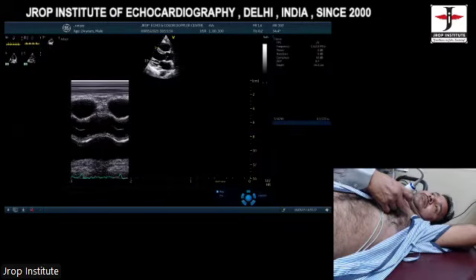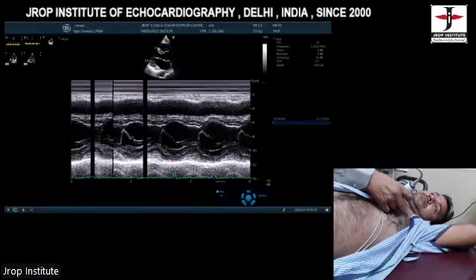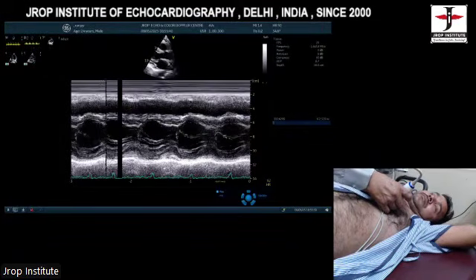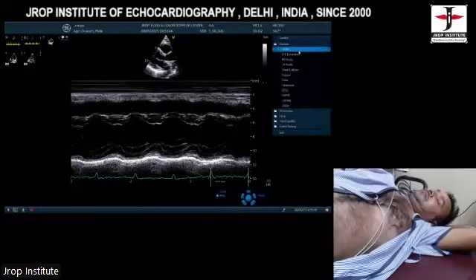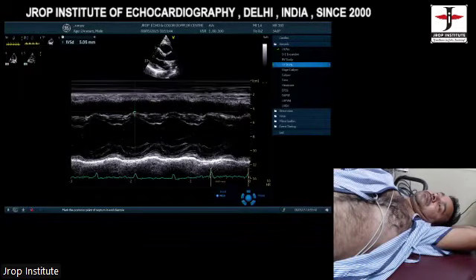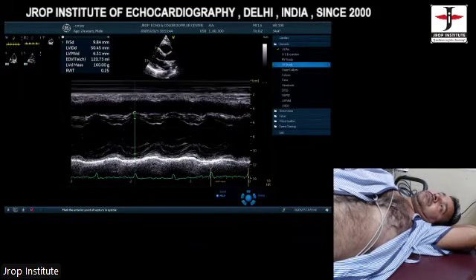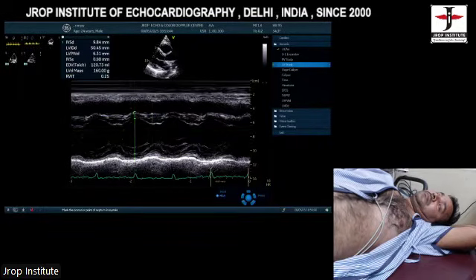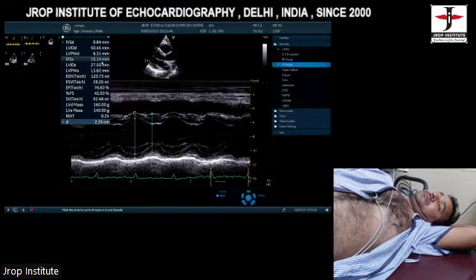Second important thing is you just move your cursor to the tip of the mitral. If you move your cursor distal to the mitral leaflet tips, you don't have to exert many things. Straightway go to LV, interventricular septum, posterior wall. In between, we could see this left ventricular dimension during diastole. Then systolic dimensions, and this is systolic. So everything is right in front of me in one minute. This is how we utilize M mode in clinical practice.